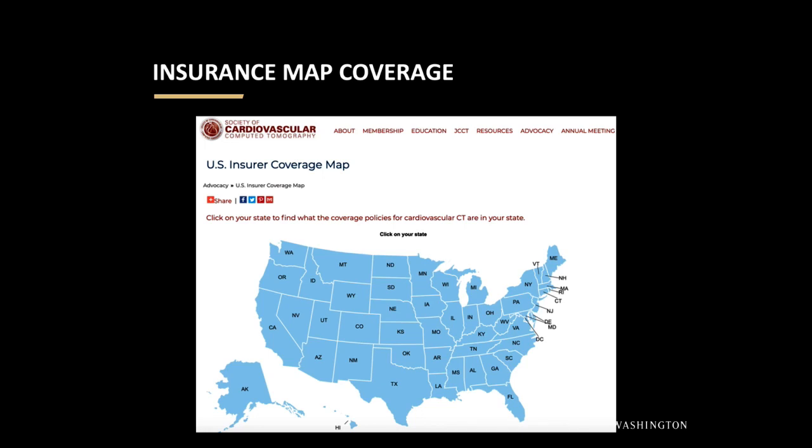So there are definitely data that are out there, but it doesn't get to the physiology just because it's such a diffuse disease. In liver transplant, there have been some small studies which have been conducted because they're already doing the multi-phase, and all they have to do is just cut up a little bit higher, and they can rule out coronary disease. So it actually would save us from the misery of dobutamine stress echoes in all these patients. So we've talked about doing this as a study here. It just hasn't been something that's been solidified.